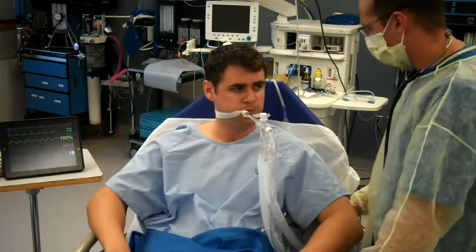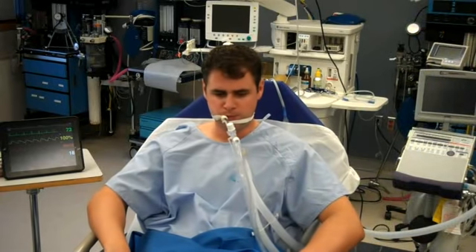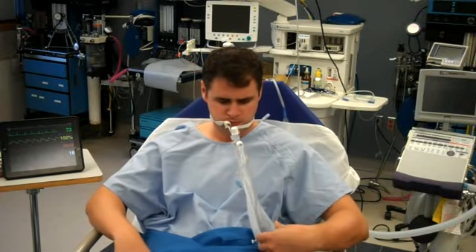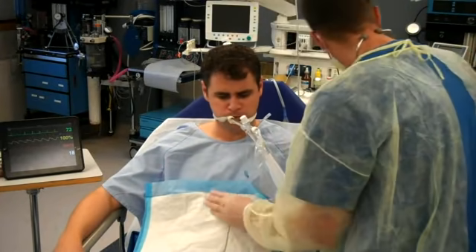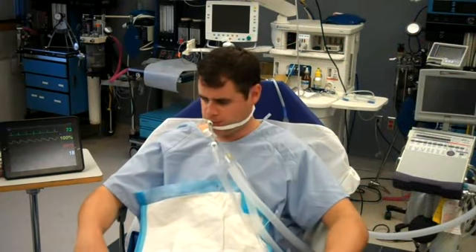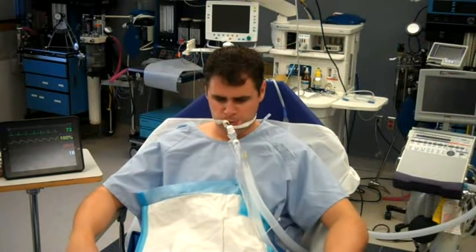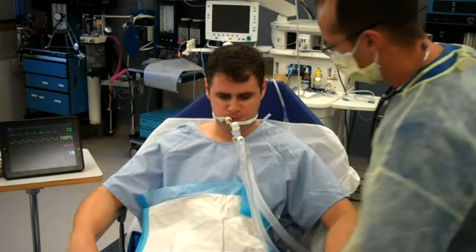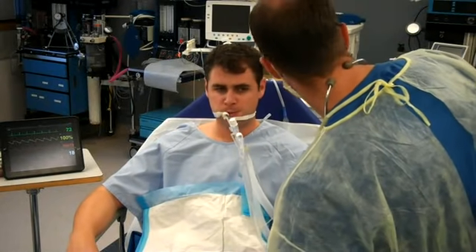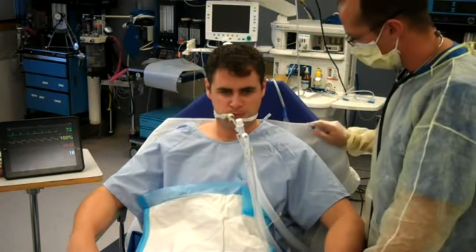Let me just get some stuff ready here. I'll just put this on your lap to keep the bed nice and clean. It looks like your oxygen is nice and well — you're sitting at 100%. We've got you on 100% oxygen just for a minute or two.